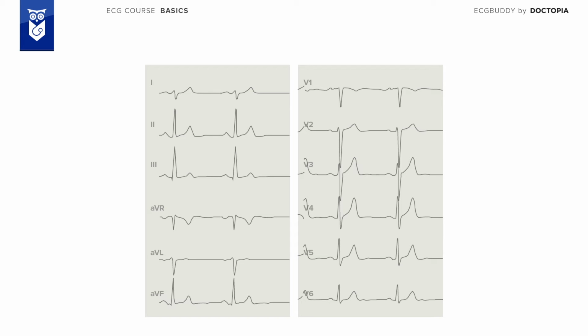The second type are called the Goldberger augmented voltage limb leads, and these three leads are denoted by the abbreviation AV. The position of the AV lead on the patient is denoted by the addition of the letter L, R, or F: AVL as in left, AVR as in right, and AVF as in foot. The third type are called the Wilson chest or precordial leads, and these 6 leads are denoted as V1 to V6. There are thus 12 basic ECG leads, which explains why we often speak of the 12-lead ECG.